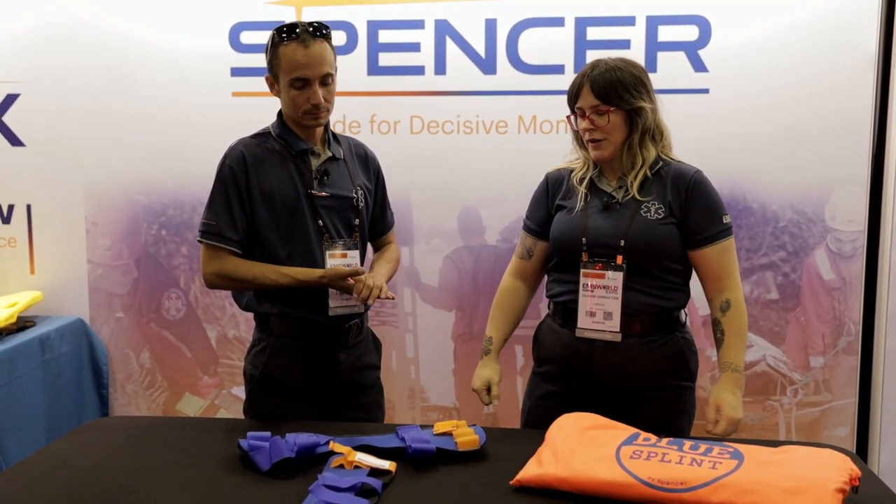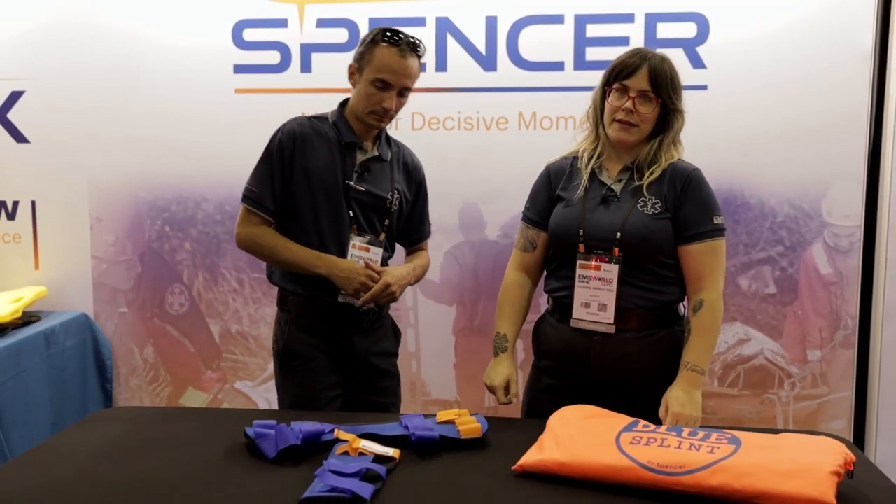Hey, it's Julie and Pete. We're at the EMS World Expo in Orlando, Florida, and we are at the Spencer booth. We're going to talk to you a little bit about the blue splint.